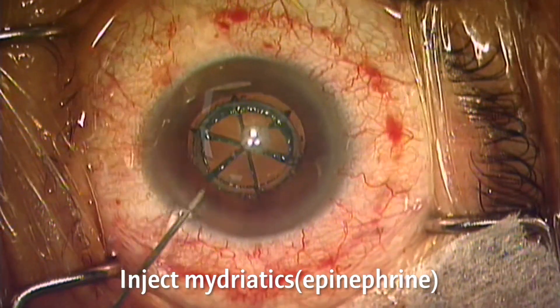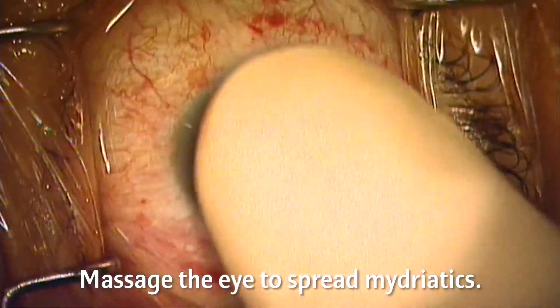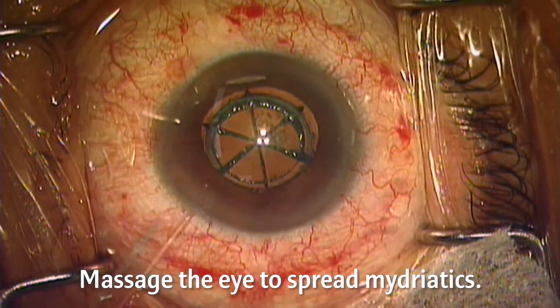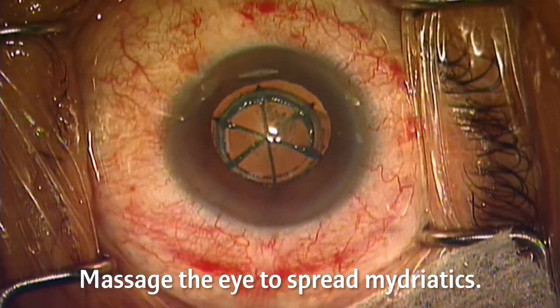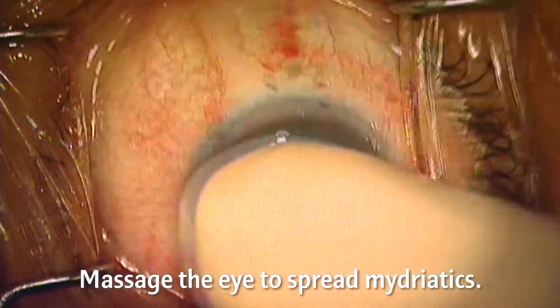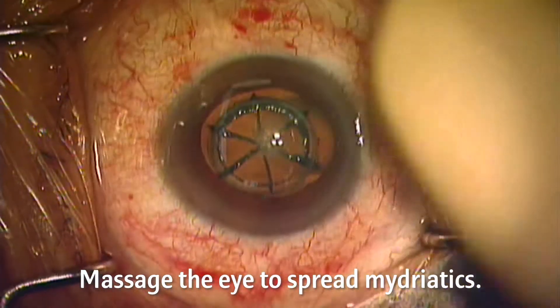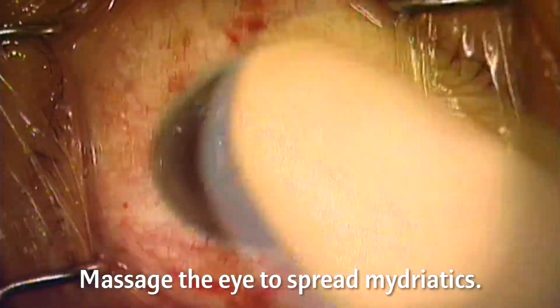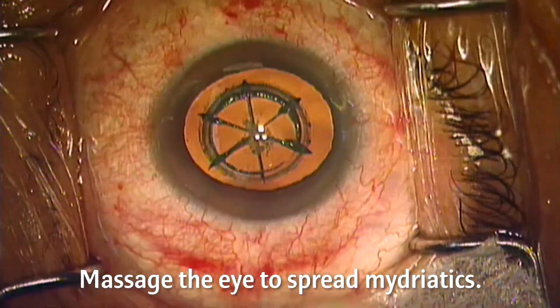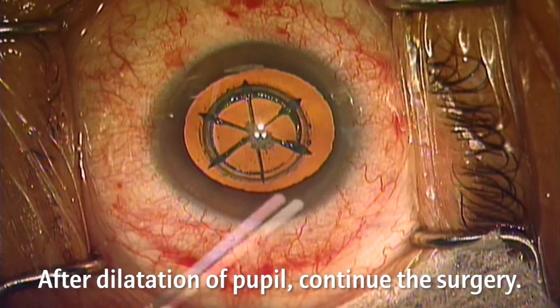Inject epinephrine. Then, massage the patient's eye to spread mydriatics. In the past, some people were reluctant and even forbidden to touch the patient's eyes, but it is fine to touch them. This is a simple and fast way to spread mydriatics quickly. If the patient's pupil is enlarged, continue surgery.